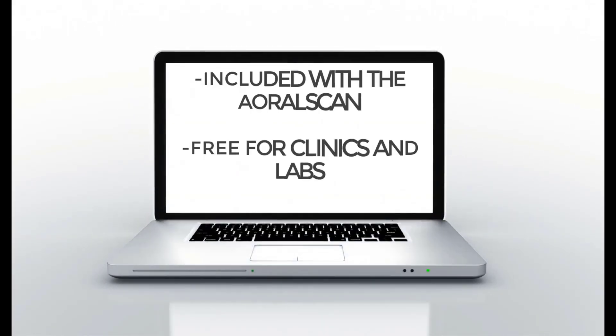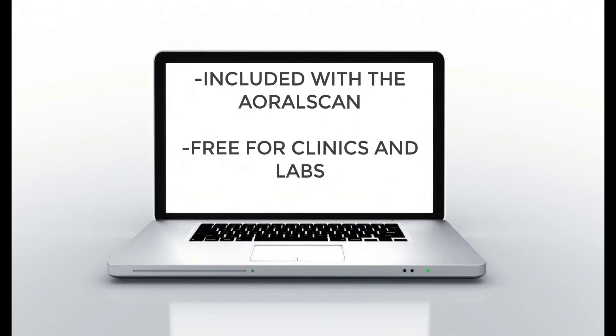The data cloud is completely free for clinics and labs and, of course, it's included with the Shining3D Aoral Scan.